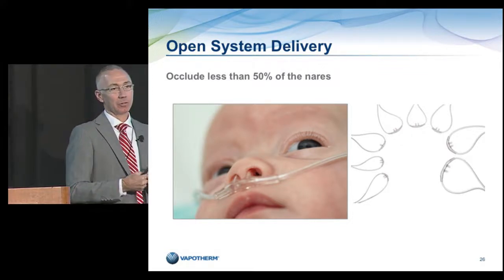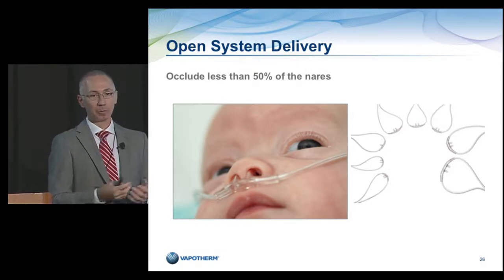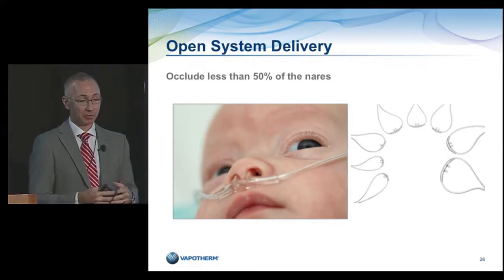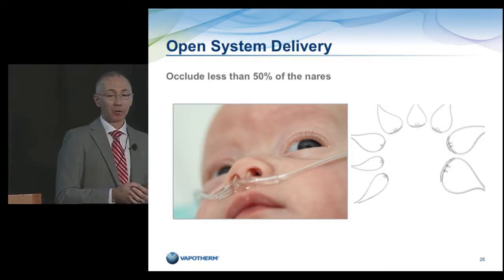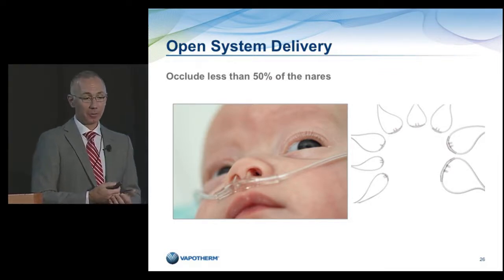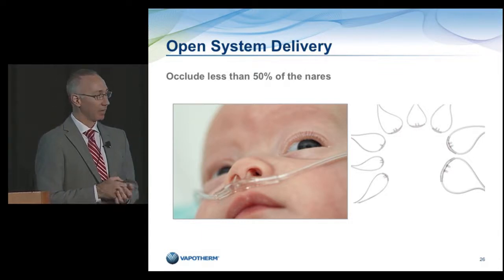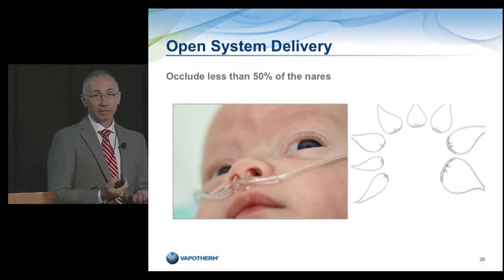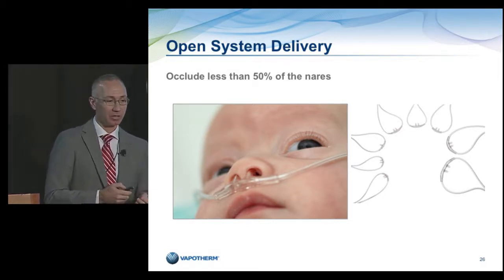When people attempt to upsize a cannula to make this look like a nasal prong, that's where you get into trouble, because you can generate significant pressure if you don't have a way of leaking, and that can be an issue. So we strongly recommend that high flow therapy should be done properly, respecting at least 50% leak for the cannula sizing. In fact, there is now a cannula called a solo cannula that delivers high flow through a single prong, and therefore it ensures that you'll have at least 50% leak on the other side.